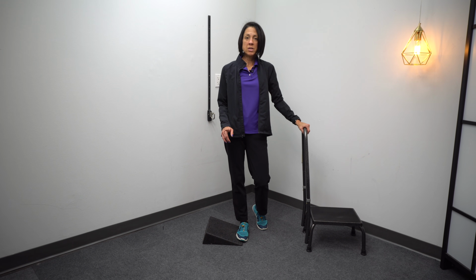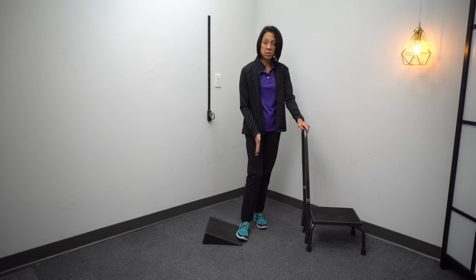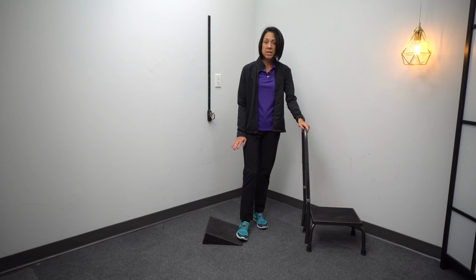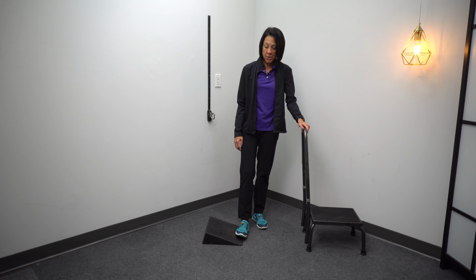Now, one thing I want to address in this video that I probably have never addressed in any other video is that if you're someone where you have a knee that looks kind of crooked or looks like it's bent when you look at it from the front, be very careful as to how much you turn that foot down. Now, for those of you with severe spasticity, it most likely isn't a problem because most of you are kind of stuck in this position. But if you are someone that notices that, you do have to be careful.